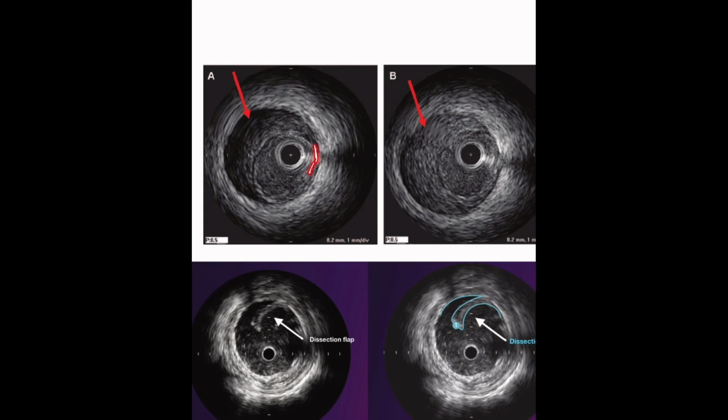So here, maybe the entry point was here, but maybe it sealed off and this wasn't moving anymore. Now the problem is from here, these two things are still communicating, that means that the hematoma is receiving blood, meaning it has the ability to grow and continue to develop.